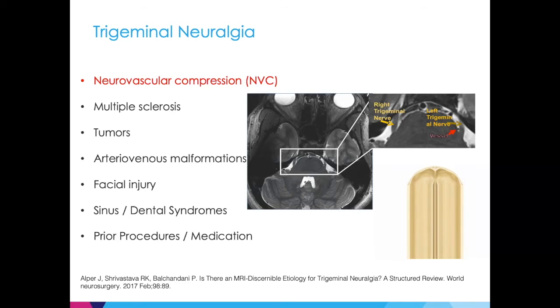Basically, the etiology of this is often not very well known. The source of the pain could be caused from anything. A vessel could be impinging upon the nerve. That's often the case, and there's a treatment for this, but then there's other issues as well, multiple sclerosis, nerve damage, demyelination, any kind of injury. And this is a place where the 7T could really be helpful in depicting these intricate structures more effectively and showing the offending vessel that is actually pushing upon the nerve.